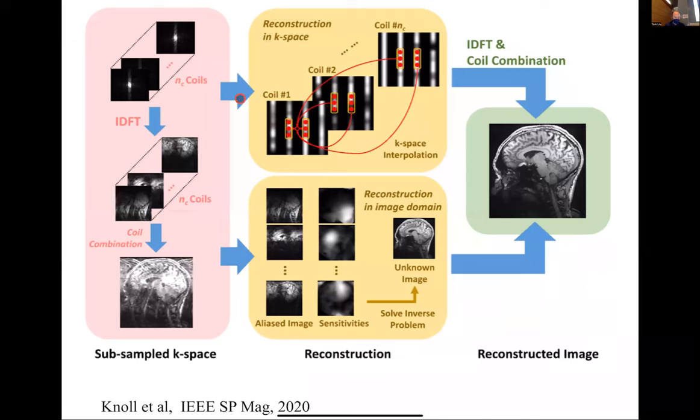So what we've done so far is basically just given you a sense of what happened in the late 90s all through the 2000s. From 2000 to 2010, that was really the era of parallel imaging. If you had been taking this course 10 or 15 years ago, that would have been state of the art, right? And so the idea was we could either do SENSE recon or we could do GRAPPA recon. In either case, you end up with something that allows you to go faster.